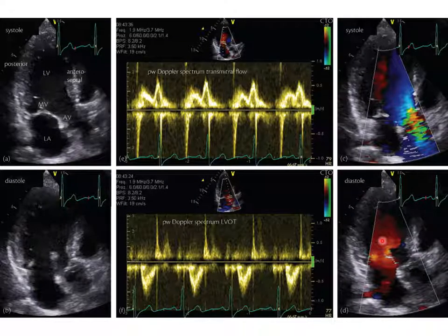And then maybe next week we'll look at some abnormal jets. So if this was abnormal, there would be a signal here, right, on this side of the mitral valve, and what color would that signal be? It will be the same as this. It will be traveling away from the transducer in the wrong direction, right? And then you can measure basically the velocity of the jet.